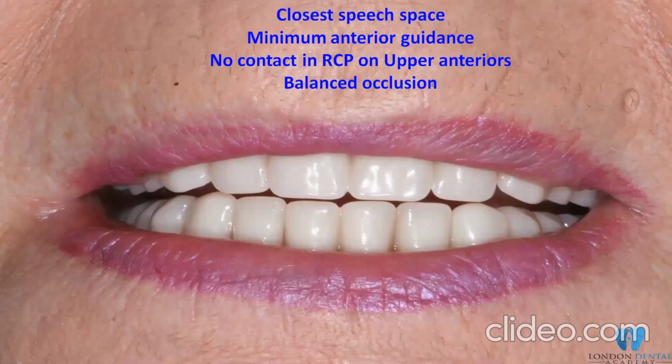And again, I think I took this picture just to show you not only the smile line, which is quite important, this lady, to show the minimum 1/2 to 2/3 of the teeth. You don't get them any shorter, otherwise you've got a problem either with the OVD, or with the inter arch space. Either way, make sure you have got a nice, lovely midline, nice smile lip support, and as you can see, try to reduce the anterior guidance as much as you can, not only in the vertical, but also in the horizontal area as well.